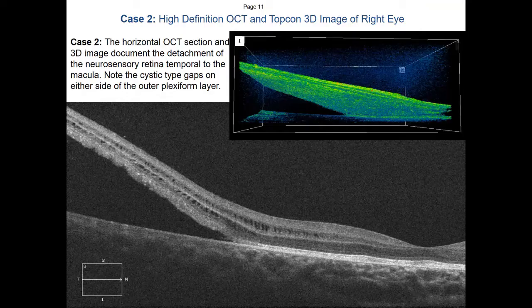on such a case. Here, a different case, we're showing a cross-section and just giving you a sense of the fovea of this patient. In 3D, you can see this separation of the neurosensory retina. Here we're seeing a separation of the neurosensory retina from the retinal pigment epithelium. So this is actually a retinal detachment, which we can diagnose just with an OCT. It's fairly typical. This is a retinal detachment where the macula is still attached.